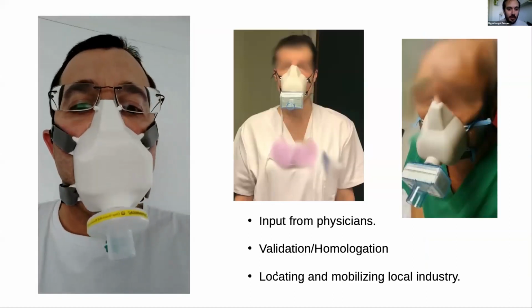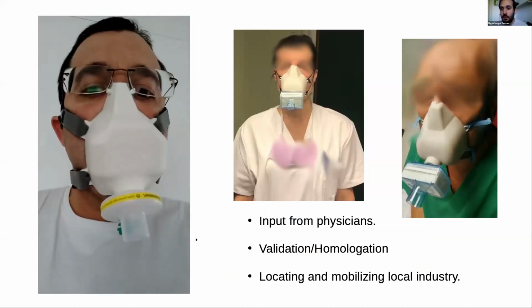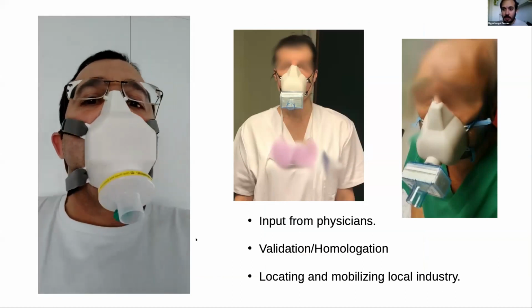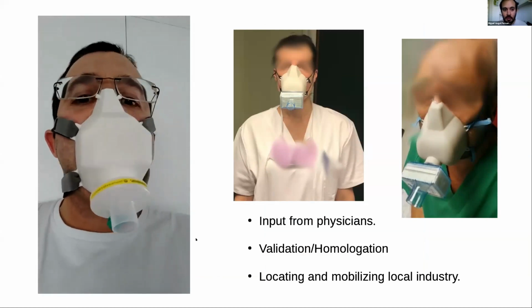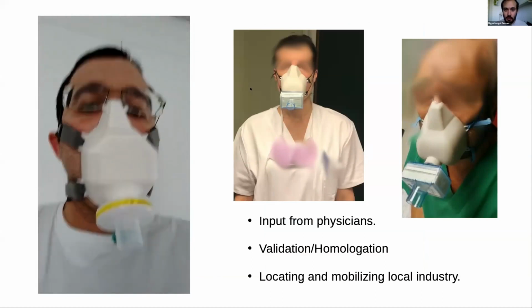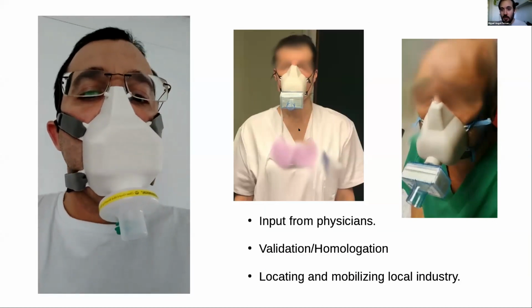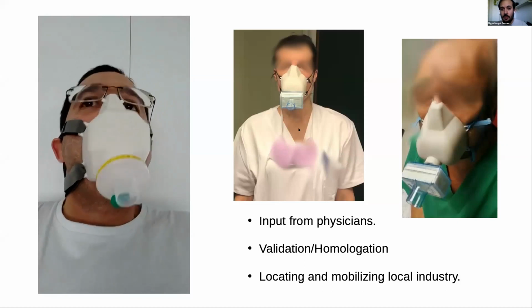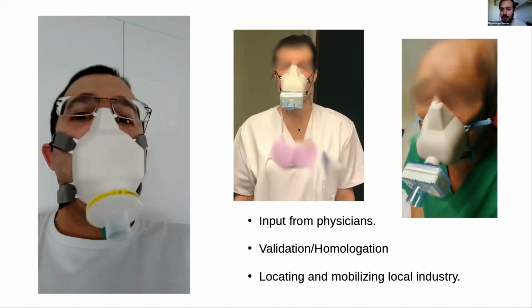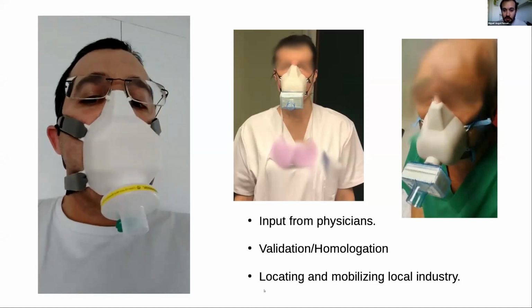One thing that many people are not aware of is that this kind of filter is already prepared for sustaining the breathing of a patient. So it already has the ability to work as a filter in a mask. Of course, this needs to be done in collaboration with the medical workers, the physicians, because they are the ones that are going to use it. And if they are not trusting the design behind it, then there is no point in us doing it. So we for sure need the input from physicians.